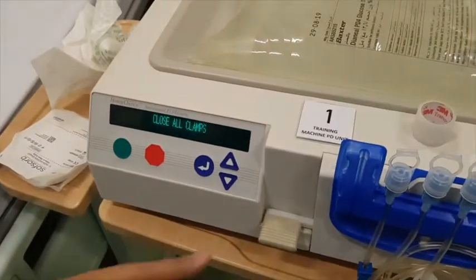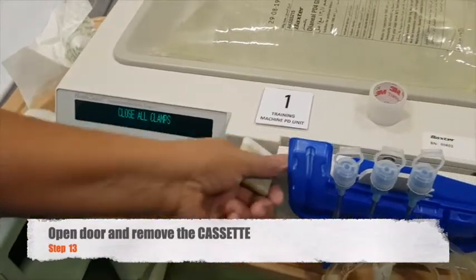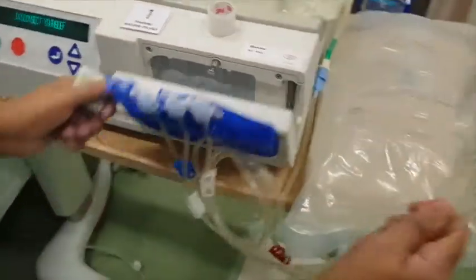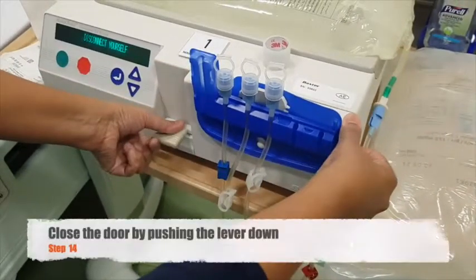We can now go back to our machine. Try to open the door by pushing up the lever and removing the cassette. Then, close the door by pushing the lever down.